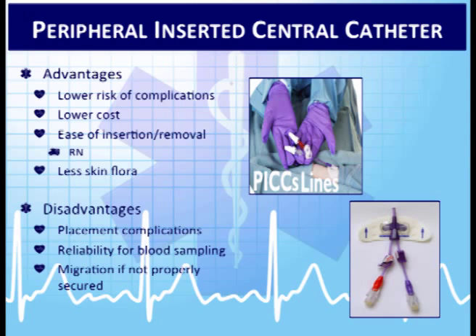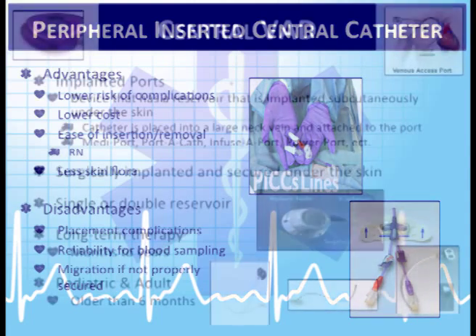So just checking if we're assessing a patient, assessing that site, making sure that it's secured so we don't go to pull on it and we're like, oh, it's not secured at all. It kind of pulls right out. That would not be a good thing. Again, these caps here, we would not use a needle to inject through those caps. Any questions about PICC lines? Again, I think those will probably be the most common device, and our mannequins have a med port, a PICC line, and a central line device that we'll be able to practice with all of those after.